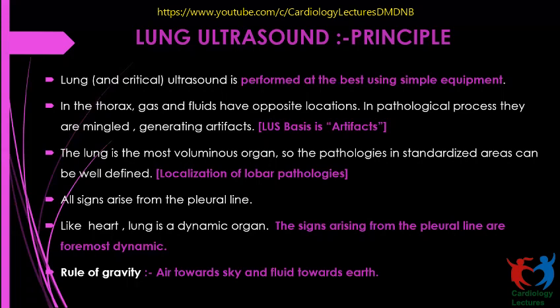Then, the last but not the least, the rule of gravity. So you know the air is usually towards the sky and the fluid is towards the earth. So when the patient lies in a supine position, visualization of the upper lung fields over the thorax will be helpful in the diagnosis of the pneumothorax and other lung conditions, while the points towards the earth, that means in the posterolateral basal areas, we can diagnose the pathologies of fluid in the lungs or pneumonias or the pleural effusions.